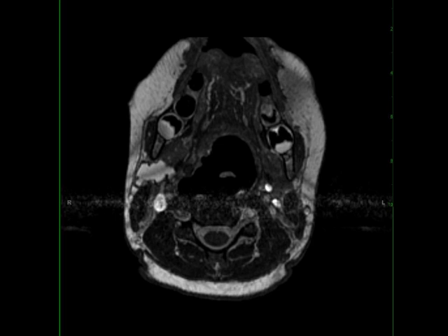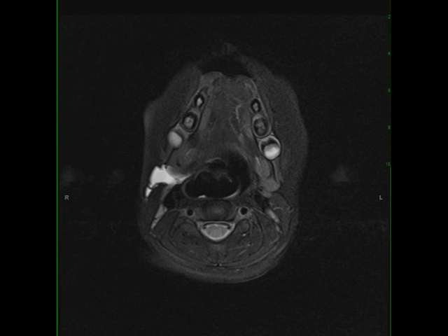This is a 21-year-old male with recurrent swelling and pain at the right mandibular angle. The images demonstrate a circumscribed T2 and proton density hyperintense lesion arising at the posterior margin of the mandibular ramus and extending posterior to the submandibular gland.